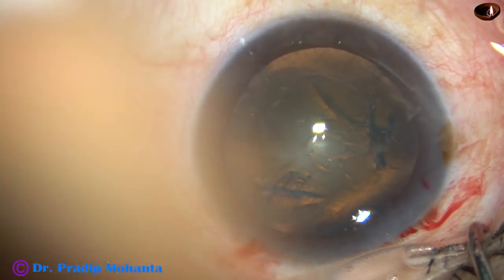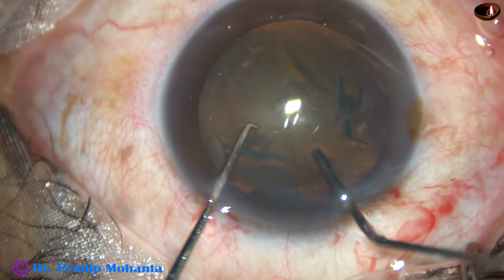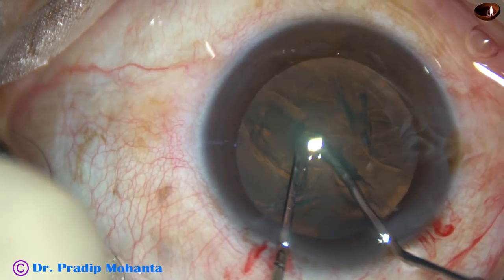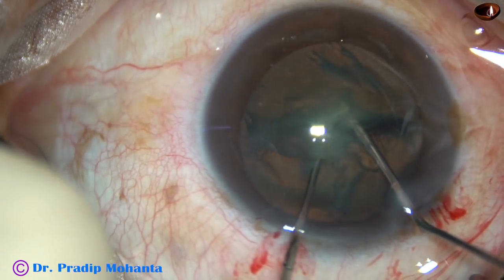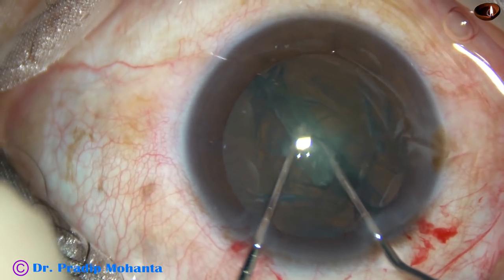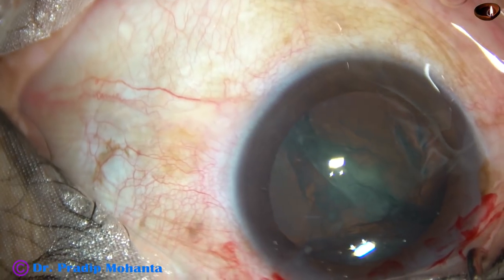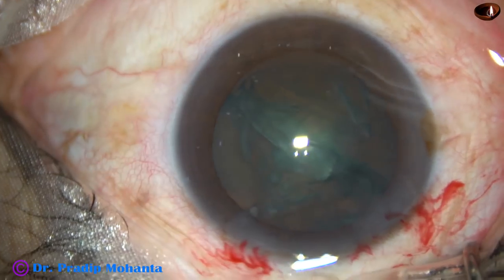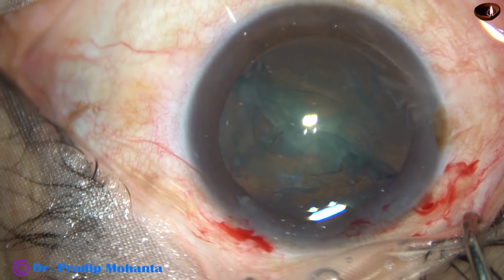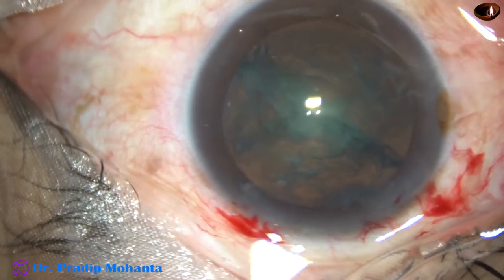And now, pre-chop with 27-gauge hydrocannula. Here goes the hydrocannula. I use the chopper, and as the two instruments meet, opposite forces are applied and the nucleus divides into two hemi-nuclei. Now, this is a soft cataract — this has been possible only by this technique. Otherwise, with the phaco needle, it won't be possible.